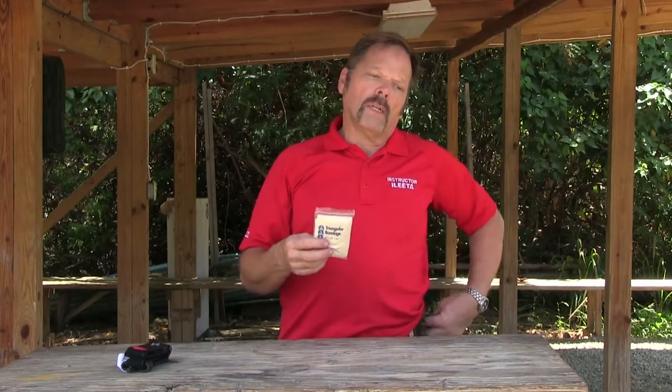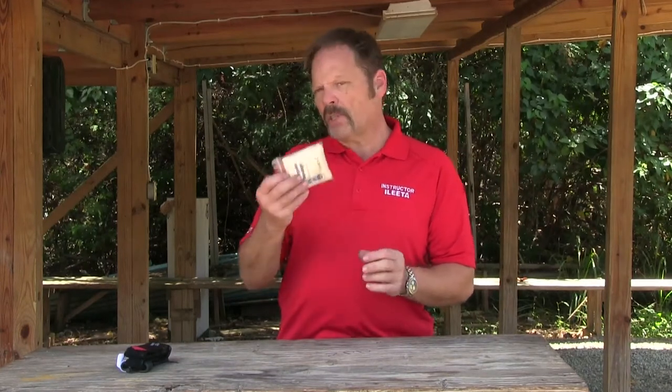Some of the advantages of the triangular bandage are that it's very small, so it's easy to have in your pocket. It's a lot less bulky than the purpose-made tourniquet, and less expensive. You can buy these at any of the major big-box pharmacy-type stores like CVS or Walgreens, and they're just a few dollars. So you can have a bunch of these all around you, and having one in your back pocket is pretty simple and comfortable. Having a few in your backpack — same thing.